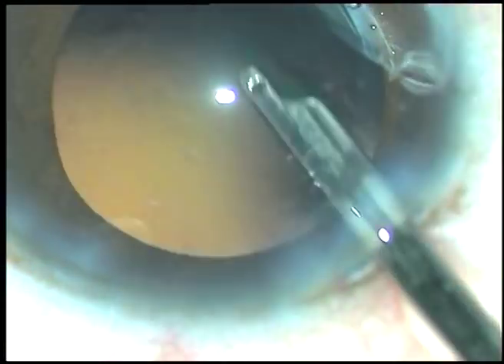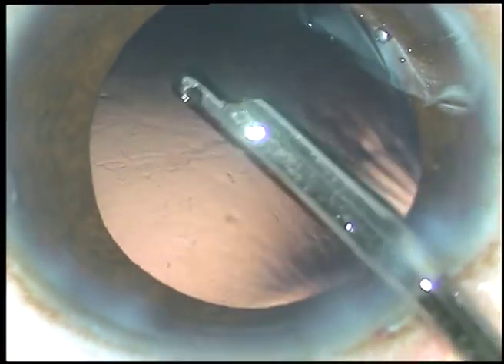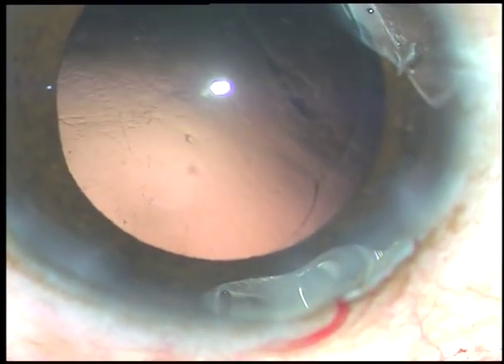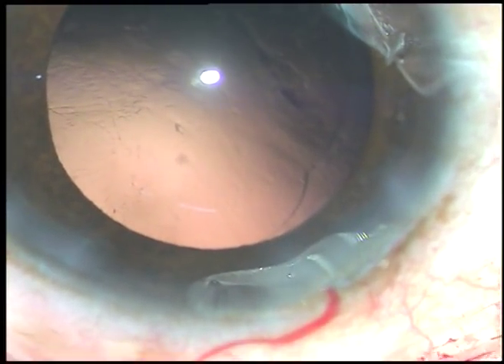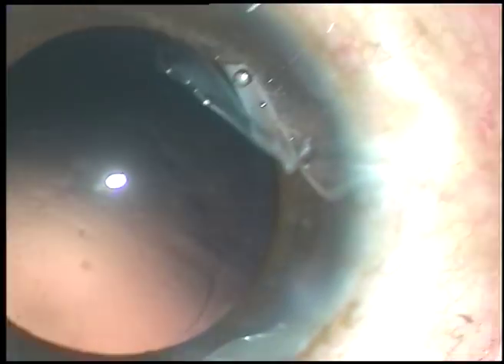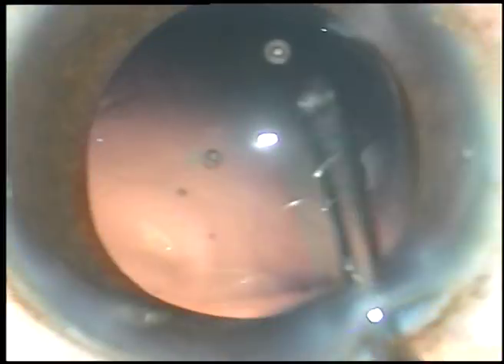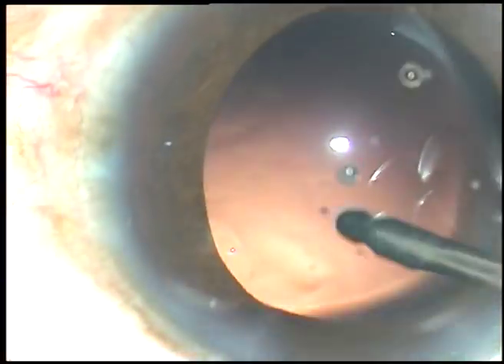In this case a lot of cells are sticking to the posterior capsule. Trying to polish with the Simcoe itself, but this is not a safe technique. The safer technique is hydro-polishing — use the fluid jet to dislodge the cells sticking to the posterior capsule.